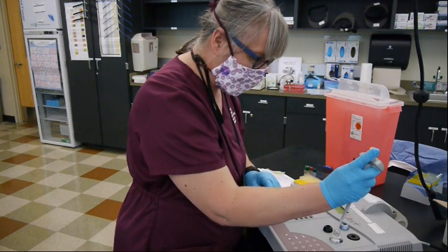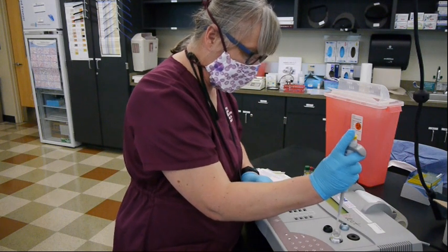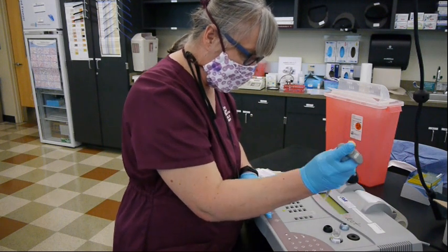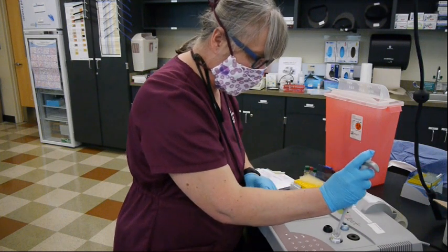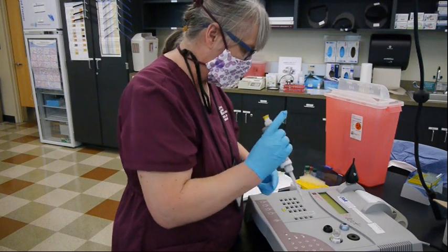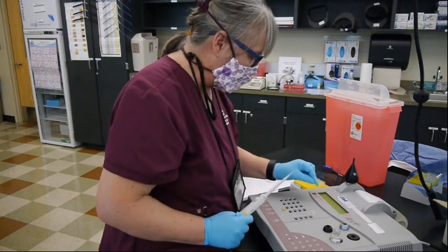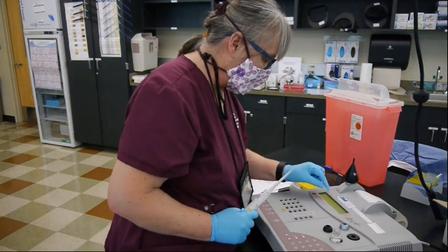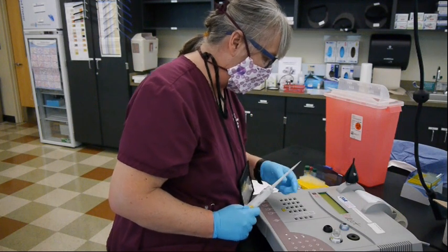And I'm hoping that I do a good enough job that I don't get any stars. Because I want to get within 5% precision between these duplicates. And so you can see in the window, again, this little pipette tube that has this little ball going back and forth, back and forth.